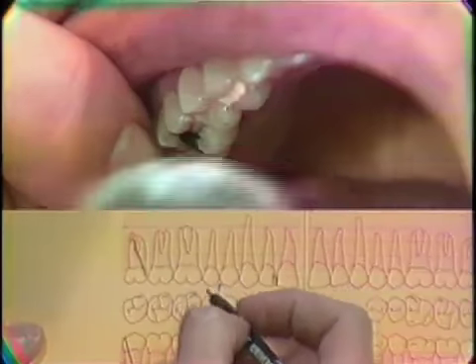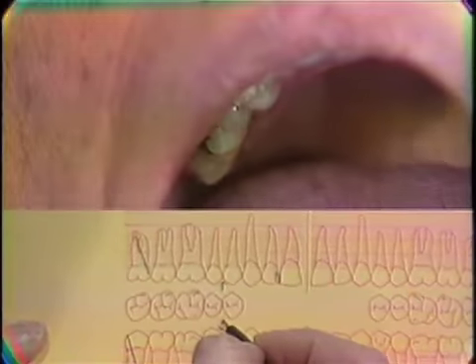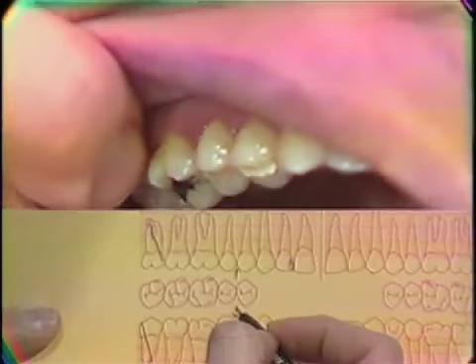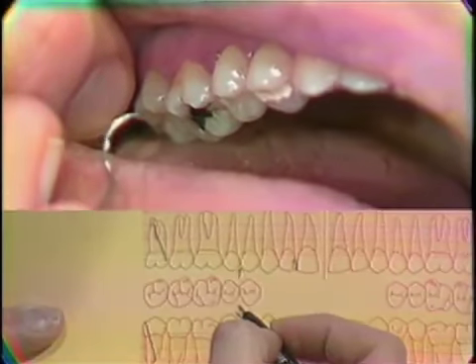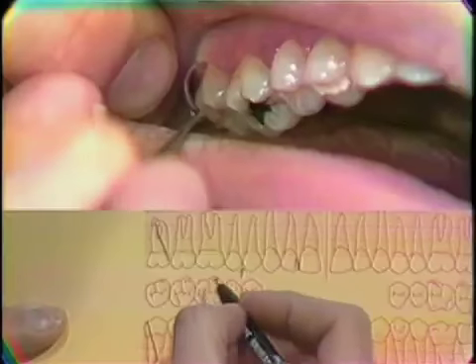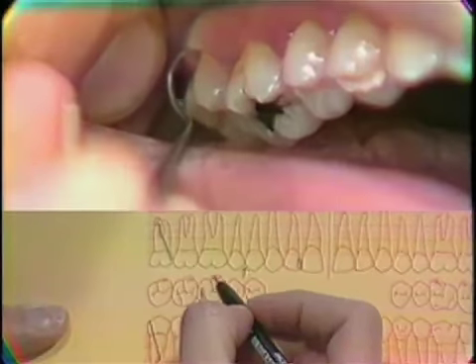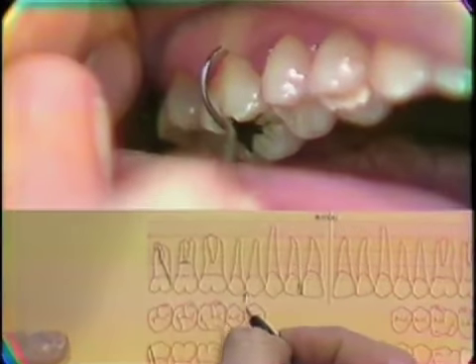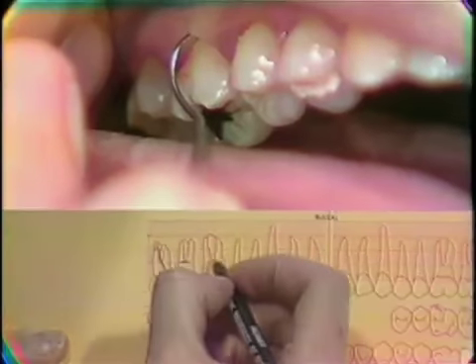Furcations? Can you turn away from me just a little bit here, please? Furcations, as I mentioned before, are recorded usually on the buccal with the use of a Cowhorn Explorer. There's a beginning furcation involvement on the buccal of tooth number 2, and a beginning furcation on the buccal of tooth number 3.